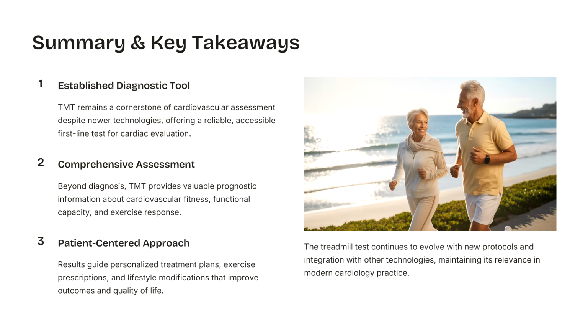What is the summary and what should you remember? Number one, an established diagnostic tool. TMT remains a cornerstone of cardiovascular assessment despite newer technologies. It is the old technology, which is much more reliable and pocket friendly. Comprehensive assessment. This can be done by the TMT: cardiovascular fitness, functional capacity, exercise response, and respiratory system response also. Patient-centered approach. Results guide personalized treatment plans, exercise participation and all.